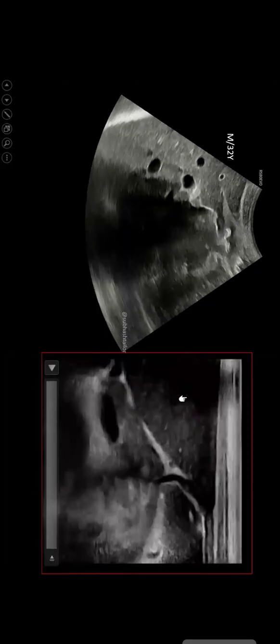Male, 32 years, presenting with upper abdominal pain, melena and weakness. So this is a routine convex scan. This is the convex probe, routine examination. This is the liver. This is the duodenal area, the first part of the duodenum. On constant observation, I could see that there is a persistent defect in the wall, so I suspected an ulcer. But this probe is not better for evaluation, so I went for a linear probe.